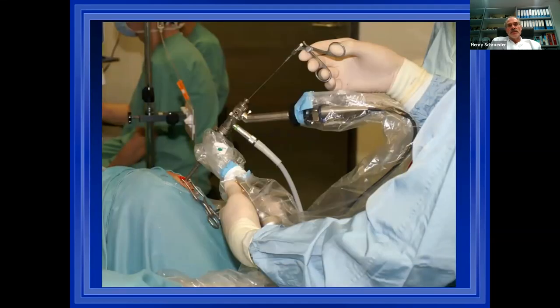With the left hand, you guide the endoscope. You go left, right, in, out. And with the right hand, you just control the depth of your instruments. Frequently, you see our pupils at the courses try to bend the forceps left and right to go there, but it's not possible because you are in this working channel. So you have to guide the endoscope left, right, in, out, just with the left hand, and with the right hand, you control the depth of your instrument and you take a biopsy.